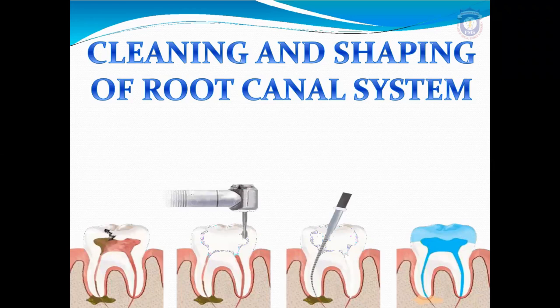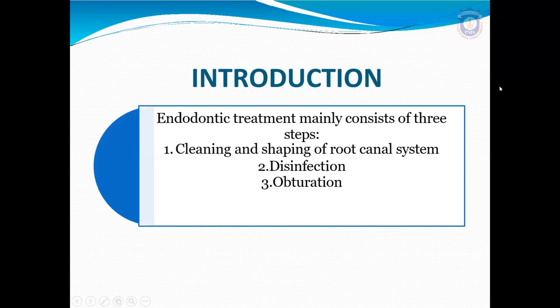Today, our topic of discussion is cleaning and shaping of the root canal system, and in specific, the step back technique for cleaning and shaping. Coming to the introduction, endodontic treatment mainly consists of 3 steps: cleaning and shaping of the root canal system, disinfection, and obturation.